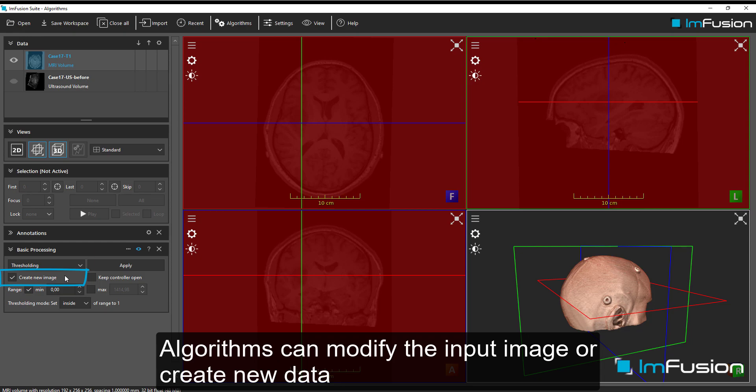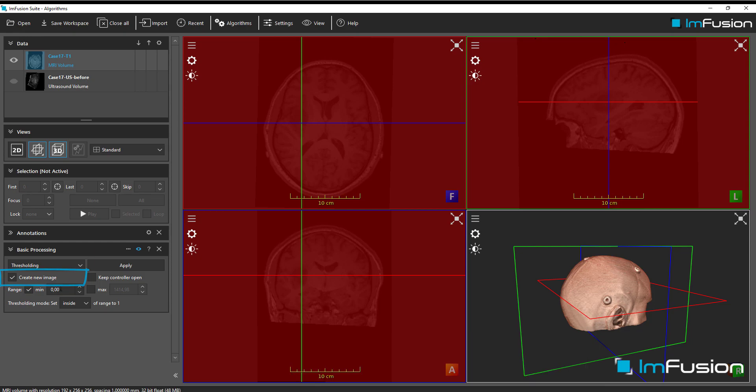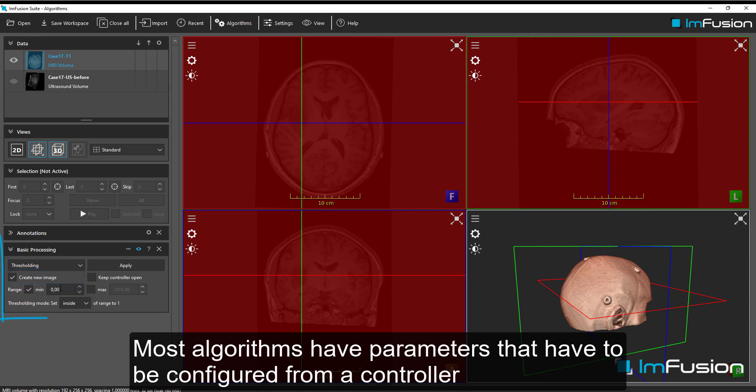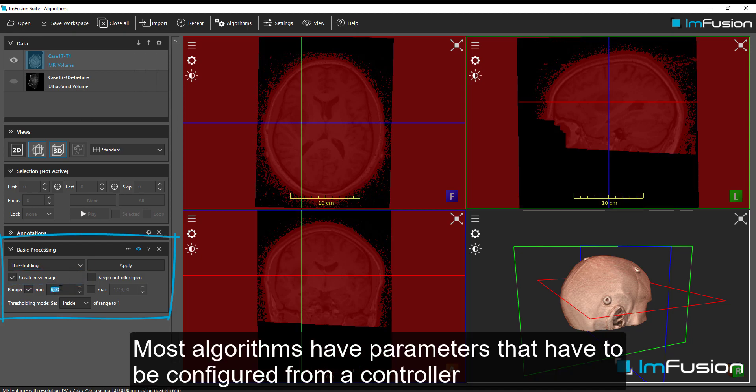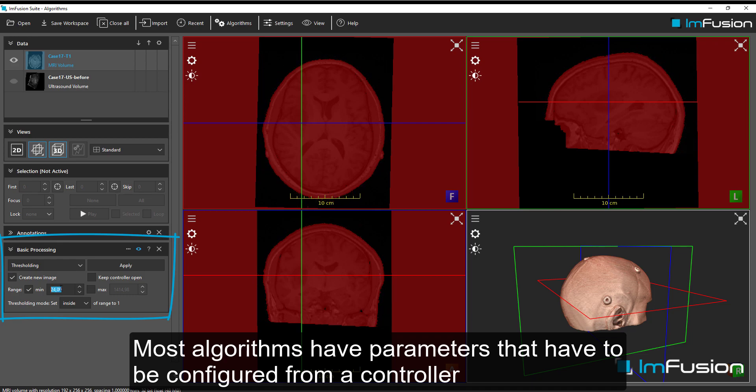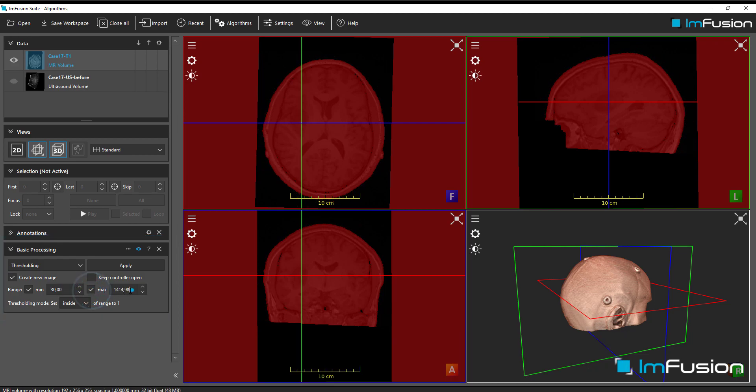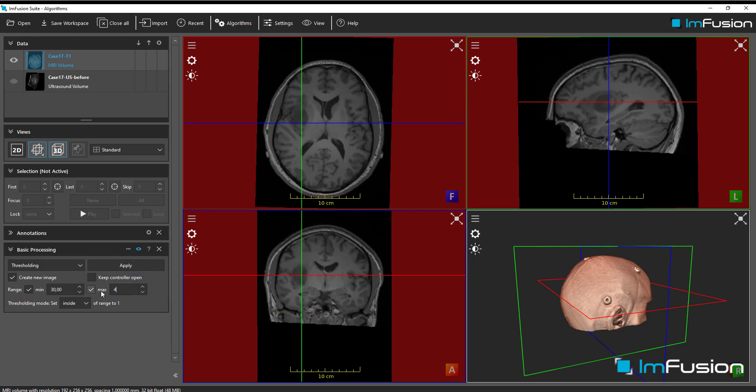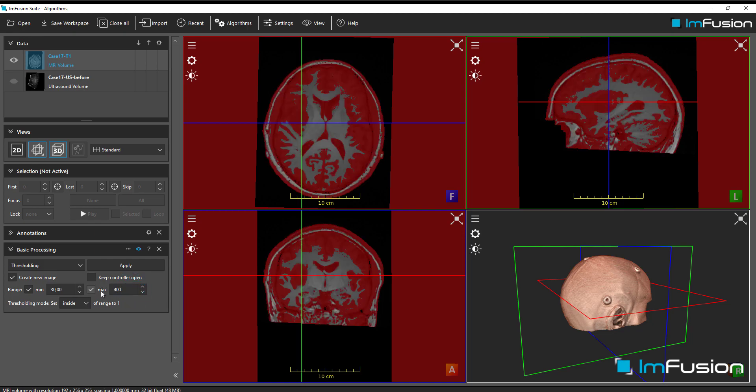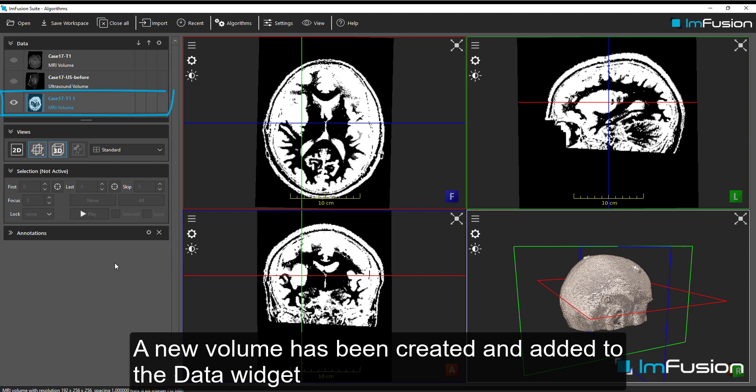Algorithms can modify the input image or create new data. Most algorithms have parameters that have to be configured from a controller. A new volume has been created and added to the data widget.